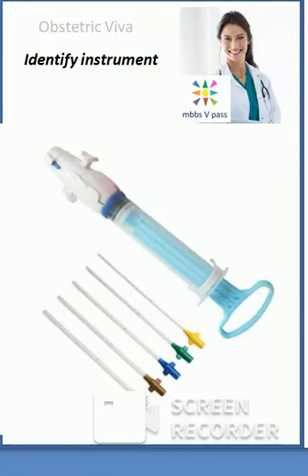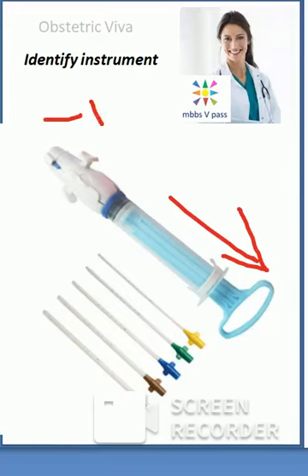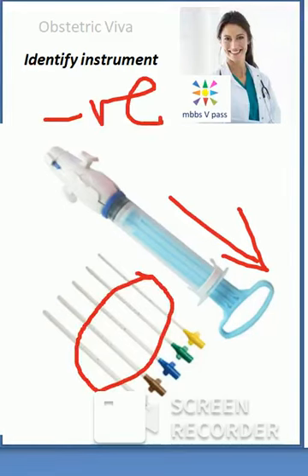What do you see here, people? Which instrument is this? So you can see this handle here. This will create negative pressure on this side. These are some cannulas, Karman cannulas. Where will they go? You will insert the cannula here. And where will this cannula go?